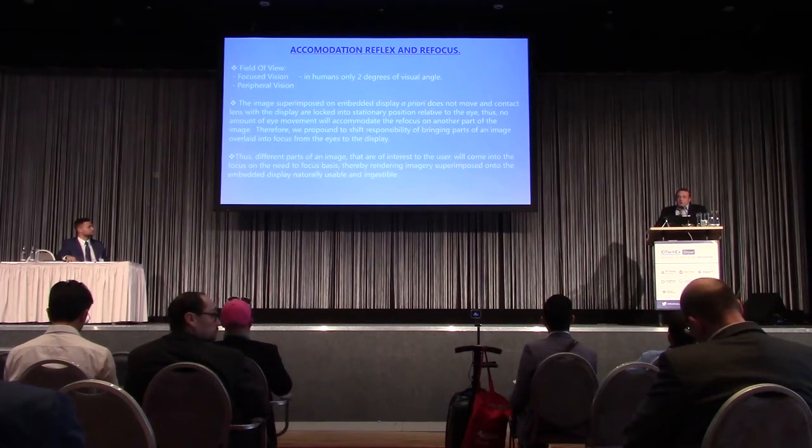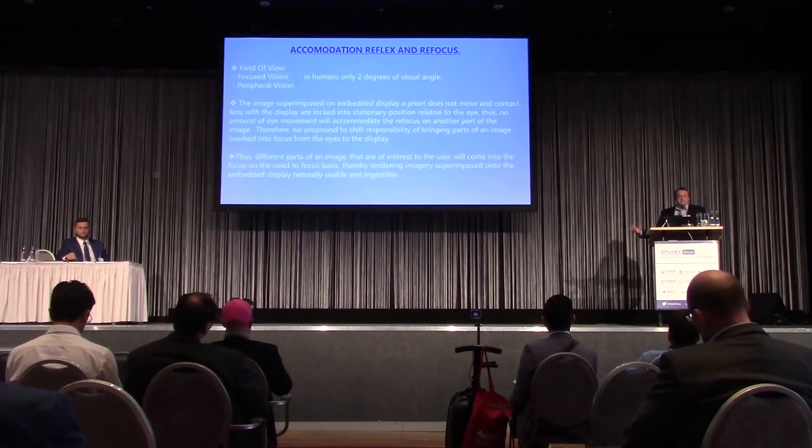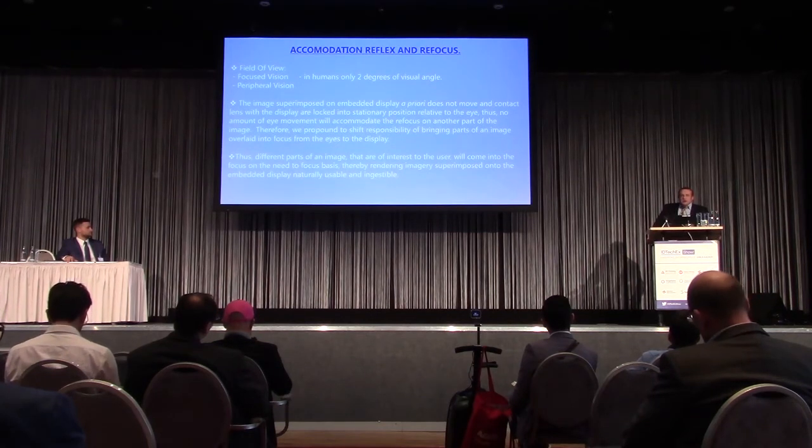What we propose is that we shift responsibility of bringing parts of an image into focus from the eyes to the display. What does it mean? It means that the image needs to shift on the display in a diametrically opposing direction to the attempted accommodation.